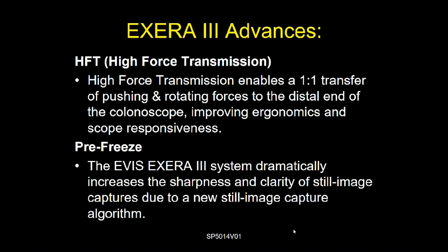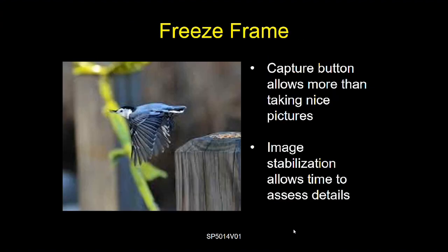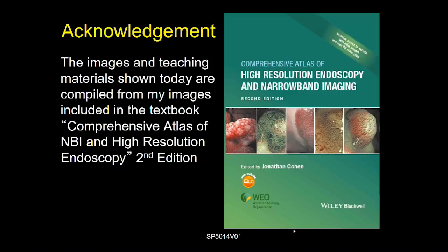So much like on a camera, when you take a picture and it takes 20 shots and averages it out to get you a very good sharp picture every time, when you hit the freeze frame, you can really see something still in motion. It has image stabilization to allow time for you to assess the details. And that's what we're going to be doing tonight.